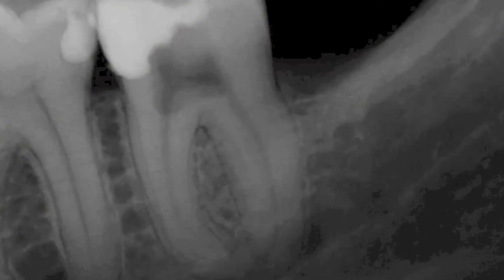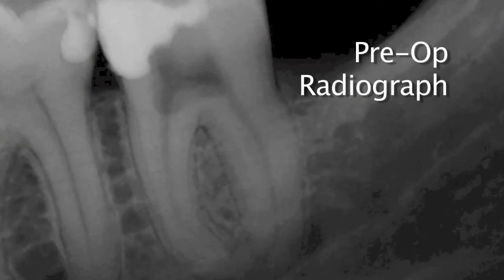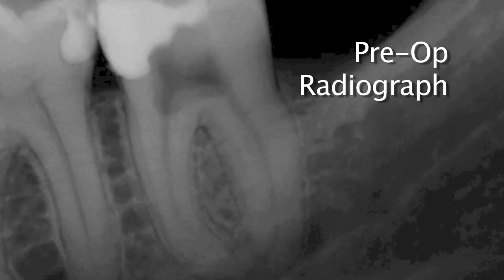Let's take a look at the preoperative radiograph. The pulpal diagnosis was previously initiated therapy and the periapical diagnosis was symptomatic apical periodontitis.